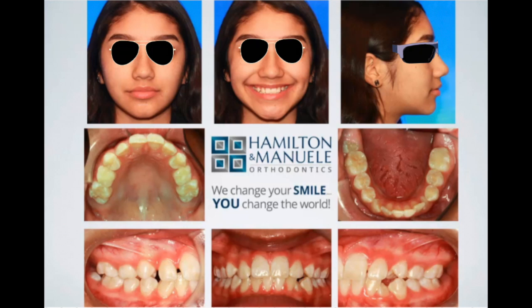Maybe, but looking at the timeline, I haven't told you how long it is between the first image and the second image, although you know it's long enough for all of our incisors to come in and all of our bottom permanent teeth to come in, so it's been a little while. You saw where the canines were before, so you would think that if they were palatally impacted, you would see some type of bulge, at least on one side, but you're not seeing that, okay?